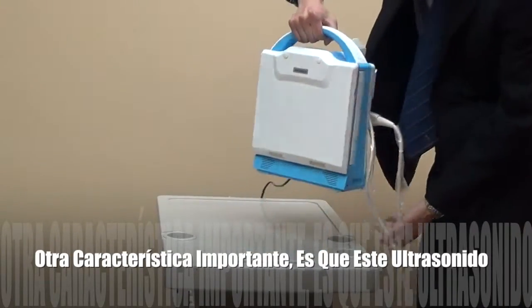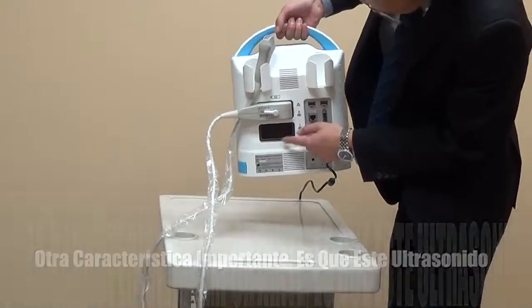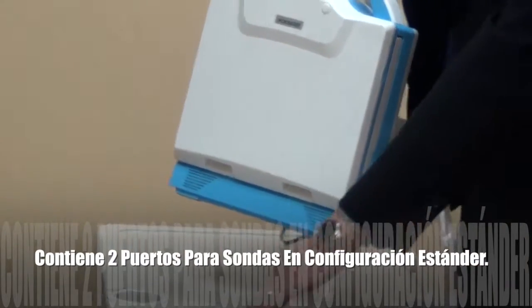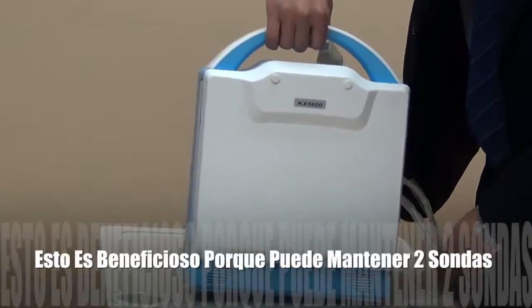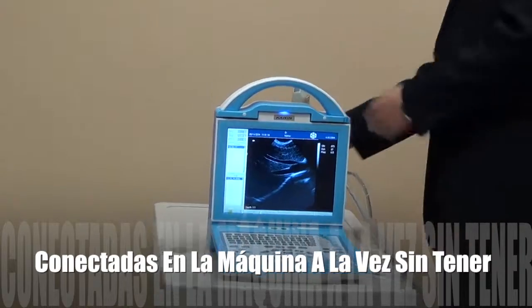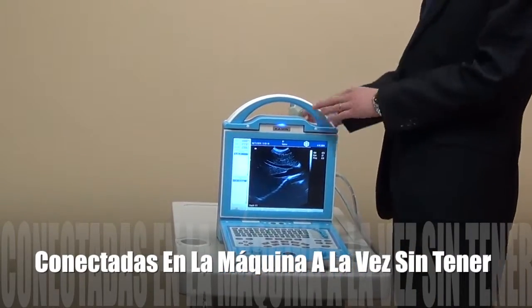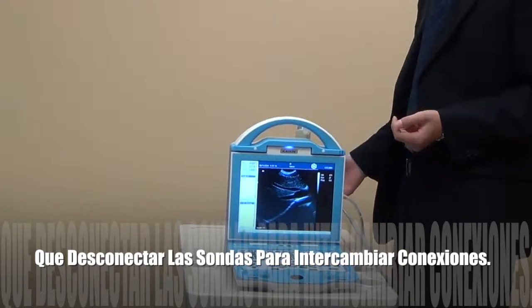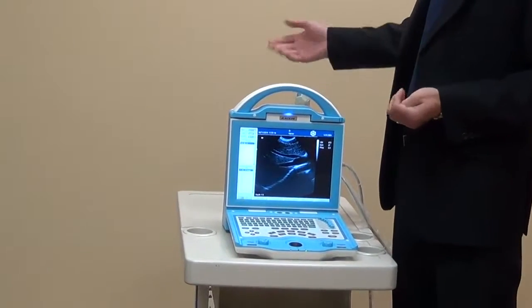Another important point: there are two probe sockets, and they come as standard. Sometimes when you work with small animals you need to connect two probes. You do not need to take one off and connect another — that is not convenient at all. But this one comes with two probe sockets as standard, which is very important.